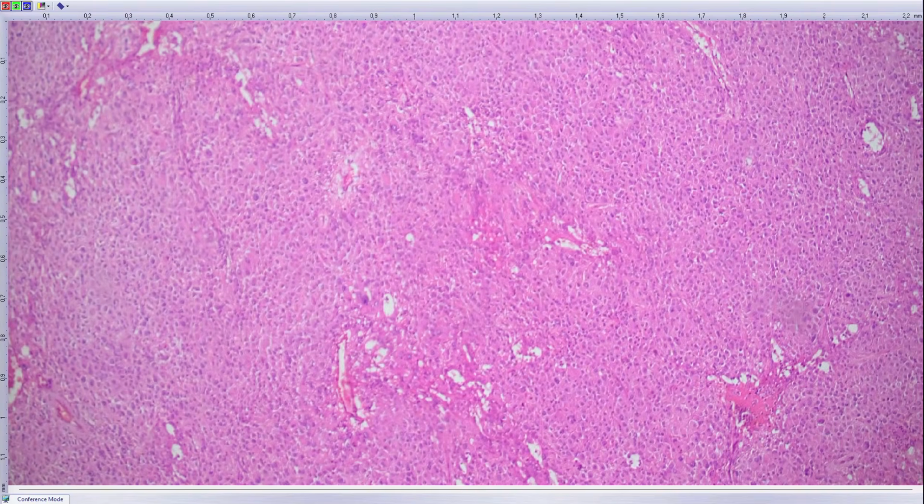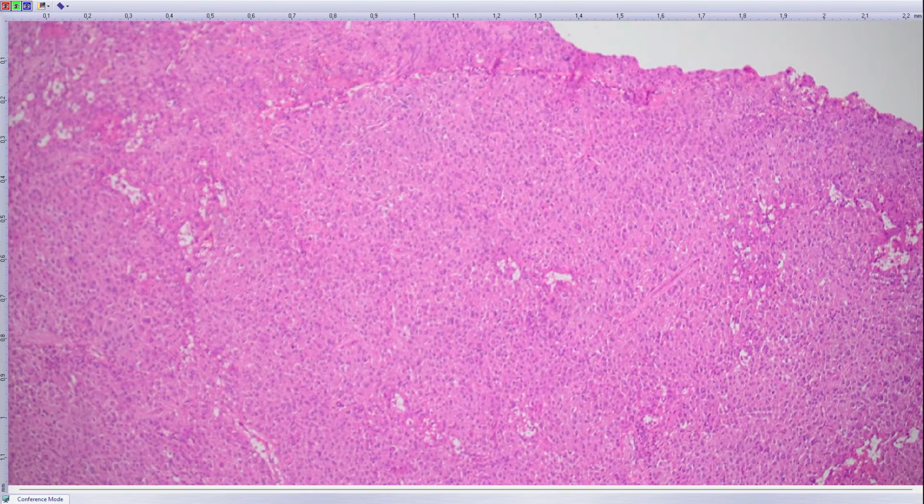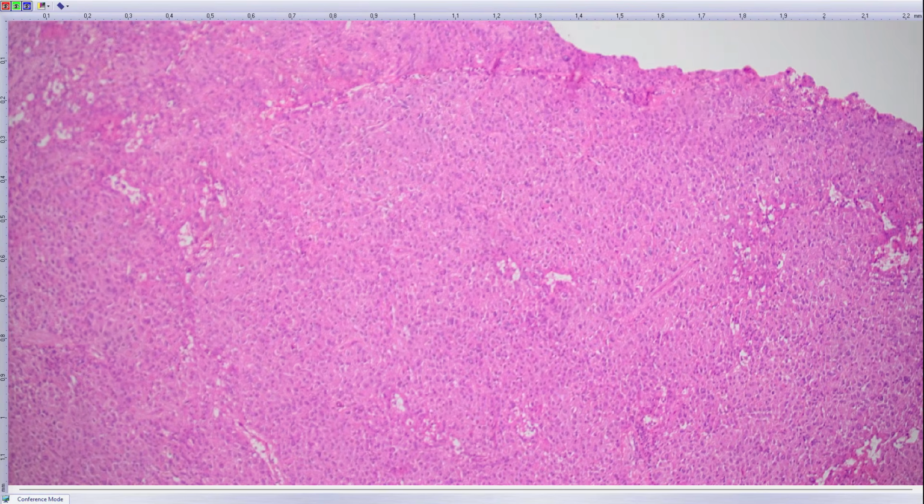And then a very important and relatively common tumor in the stomach, which is GIST, of course, gastrointestinal stromal tumor, which typically presents with spindle cell morphology, but about 10 or 15% of cases are caused not by KIT mutation, but instead by PDGFRA mutation, which is a similar kinase gene.